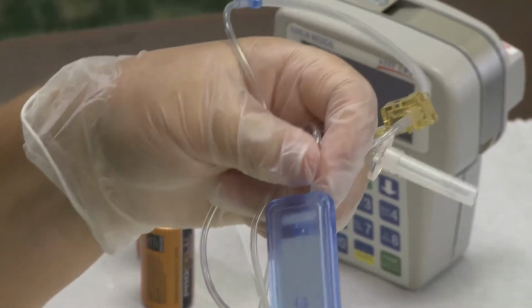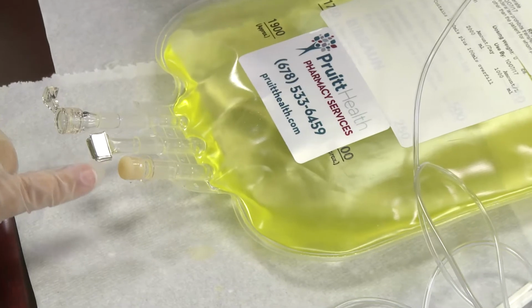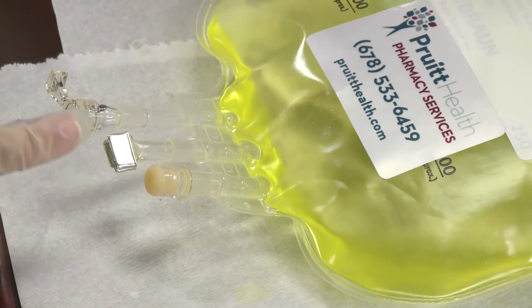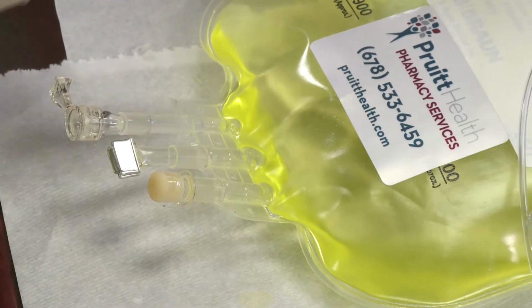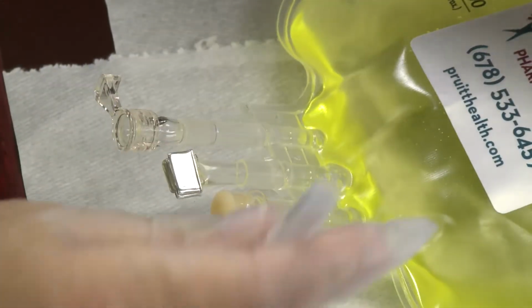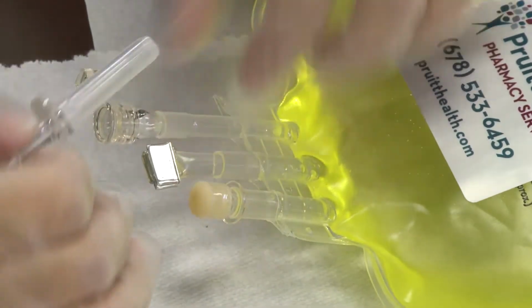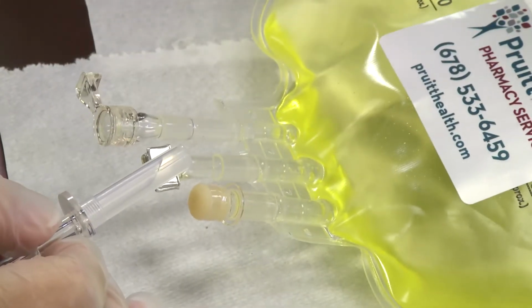Now we're going to look at this bag again, and we're going to look at these three ports that we talked about. This is the one we use to put the multivitamins or any other medicines that the pharmacy tells you to put in your TPN. This is the one port that the pharmacy only uses to put things in and make your TPN. And this is the port that we need to use to put in the tubing. Once we put this spike of tubing in here, we're going to push it in far enough to break a membrane in here, and the TPN is going to start running through here.